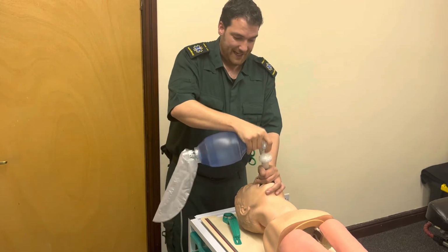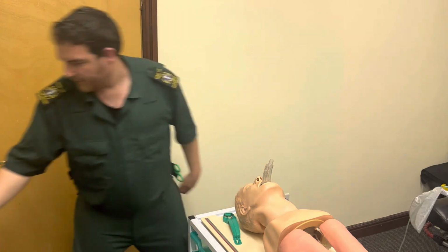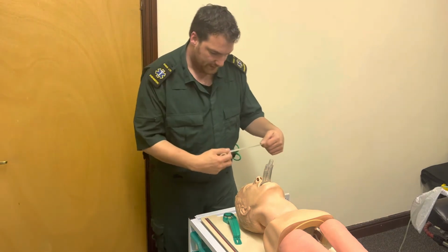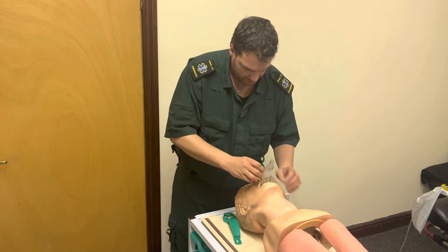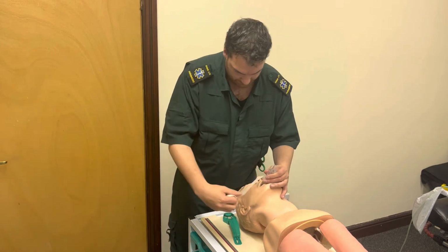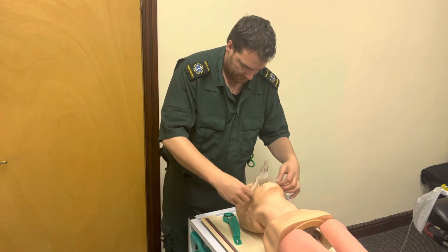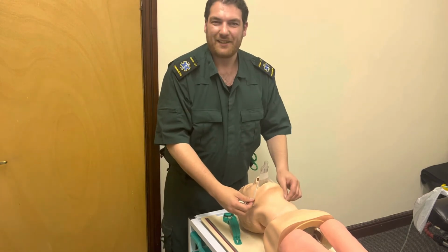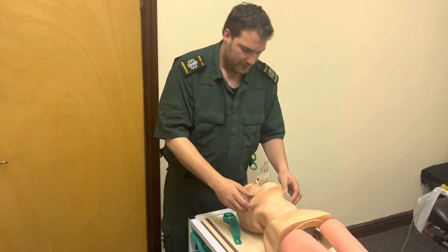And now what I'm going to do is take this off. Now I've got to tie this down because it's got a good seal. So I'm going to use some tape, and I'm going to tighten it down like so. You can do a number 8, like that. Be careful of the lubrication. Rip this off like so. Alright. Not the best tape, but that's what you would do in that sort of way. So it goes round and it keeps that there. You can use a Thomas tube holder, but don't worry about that.